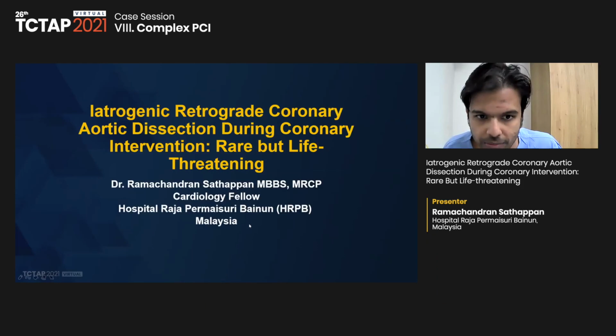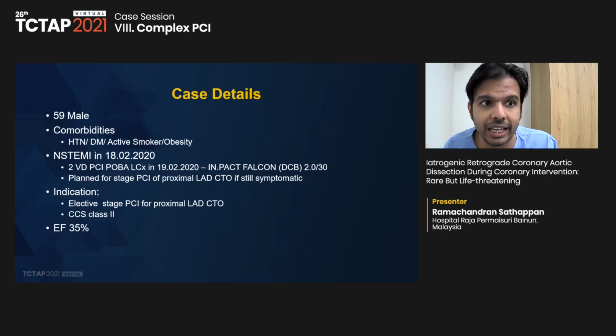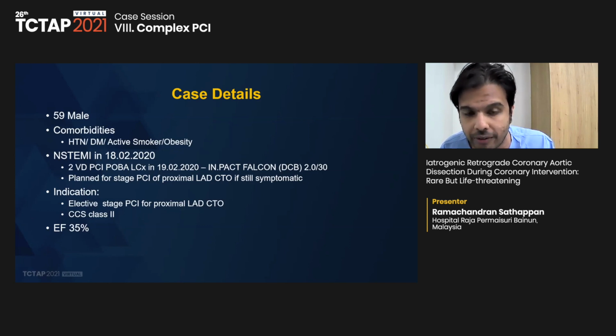Let's welcome Dr. Sasapan. Okay, so basically I'm Dr. Rama. I'm from Malaysia. I'm a cardiology fellow. So I'll be presenting on iatrogenic retrograde coronary aortic dissection during a coronary intervention. I have no disclosures, and my case is a 59-year-old male with the routine comorbids as listed here. His index event was a non-ST elevation MI in February 2020, where the culprit vessel was a distal circumflex, and we treated it with a drug-coated balloon in this region.